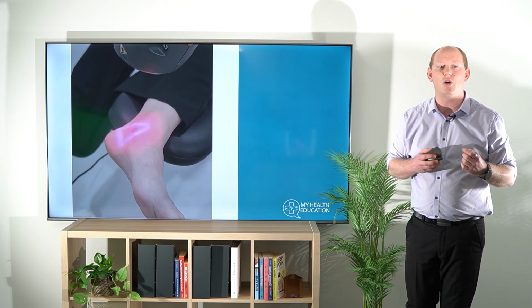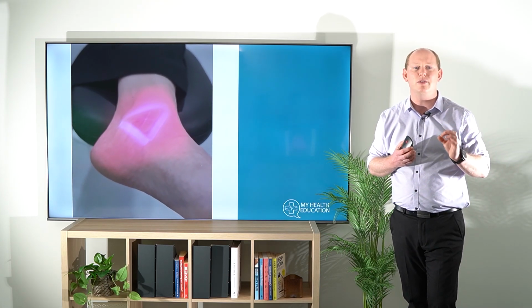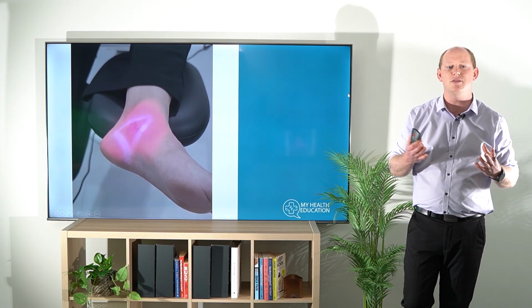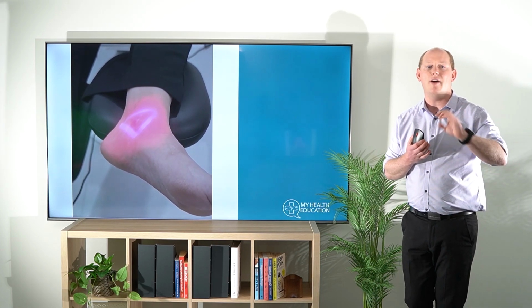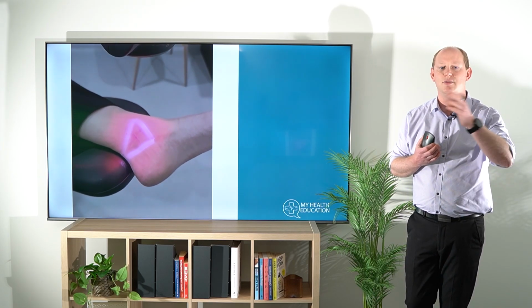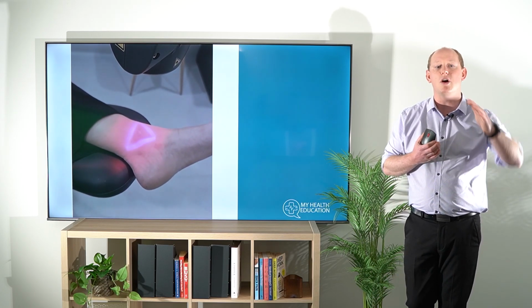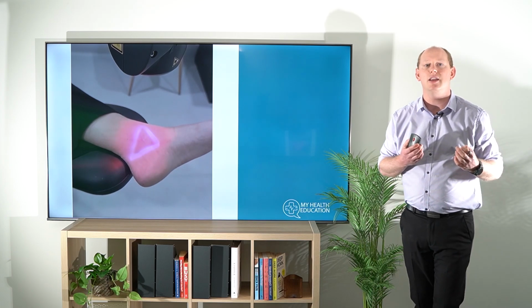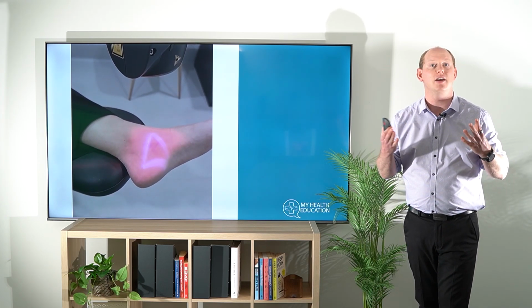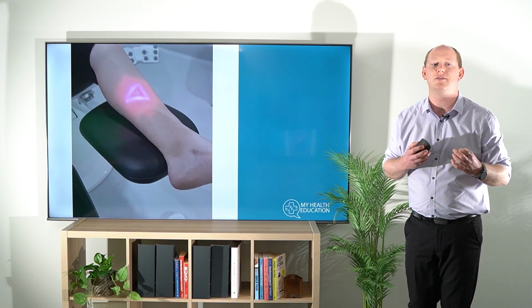Let's take a quick look at what this looks like. You can see here that I'm treating just more locally with my anti-edema and getting that whole area where I can, where there might be some swelling. After that, I'm then going to be doing that whole rear foot with regards to the tendonitis. And here we can see a little bit more of how high I'm going with that, as well as how much more anterior I might be going as well, to make sure that it's as effective as possible. I really do like to treat as comprehensively as possible.